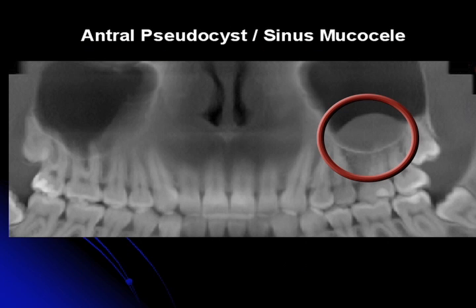This is a sinus mucocele or an antral pseudocyst. This is not uncommon to see, and a lot of times for implant treatment planning, clinicians want to know, okay, I see this thing here, what do I do with this?